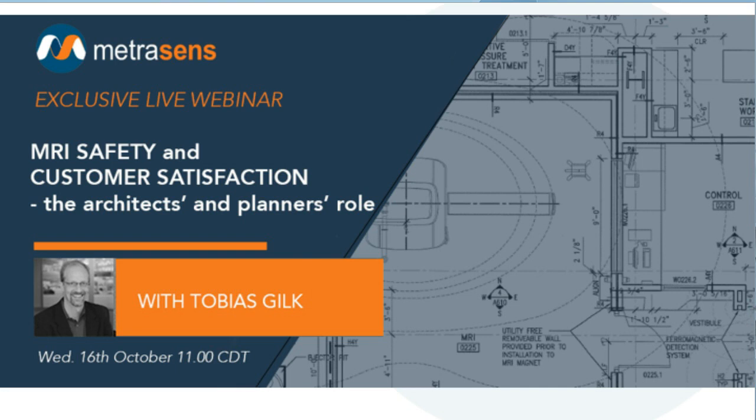So I hope that answers it, and I apologize for being the one who really sort of set in motion the all doors must swing out kind of standard. It should not apply today with contemporary MRI siting and planning and the radio frequency door types that we see.